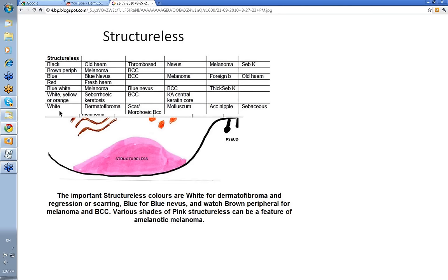We go with Structureless color: black, brown peripheral, blue, red, white. And pink should be in there as well, because sometimes pink Structureless is a feature of amelanotic melanoma. We'll show some of these shortly.